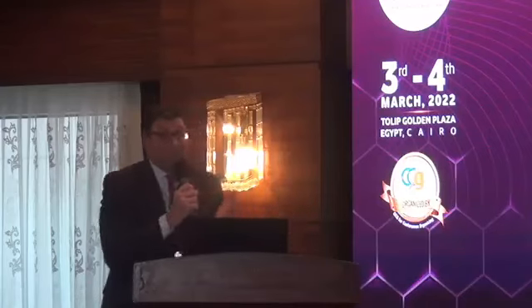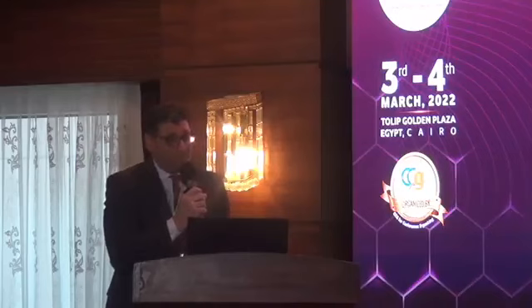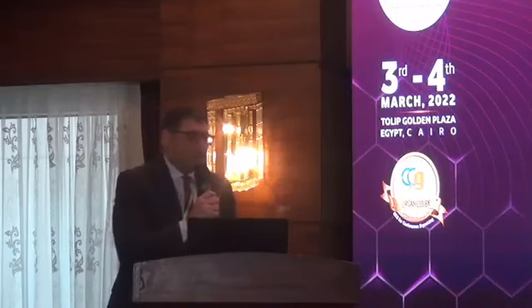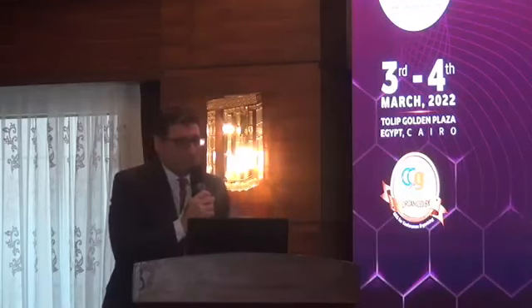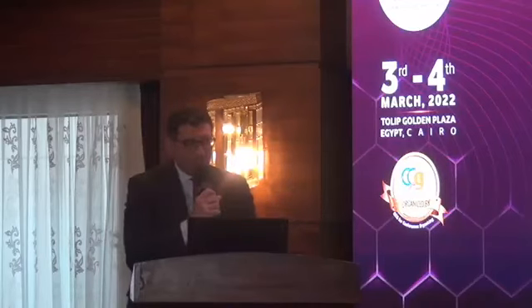With patients with status dystonicus, sometimes it is a palliative measure, because the DBS might stop the dystonic storm they are in, but it does not cause functional improvement, for example. Sometimes in the literature you can find some sort of improvement, even more than the baseline, but it can be palliative in patients with status dystonicus.